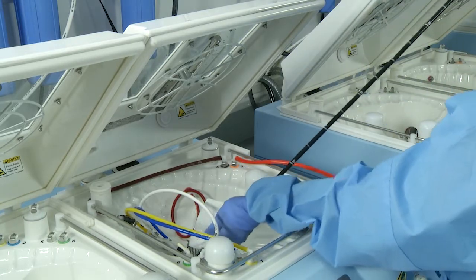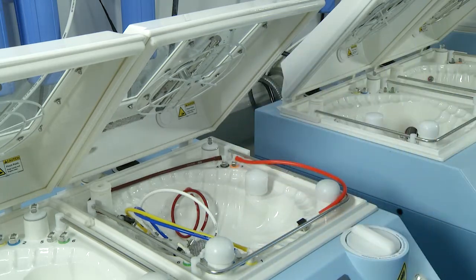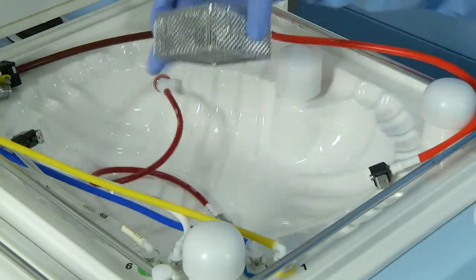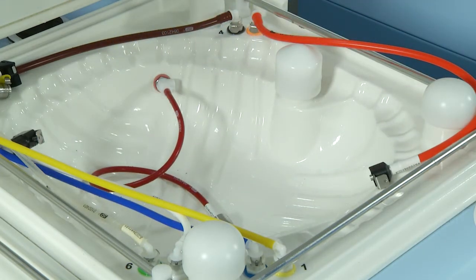Dry and store the scope following departmental policy. Finally, remove any accessories from the mesh basket and store them according to your facility's policy.